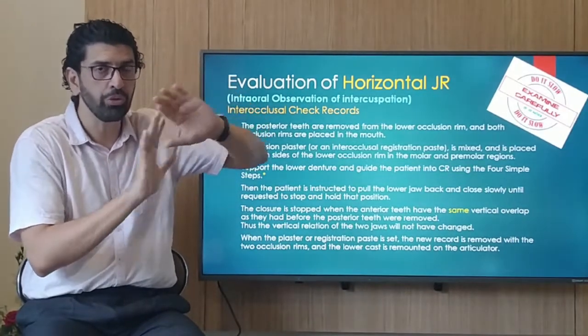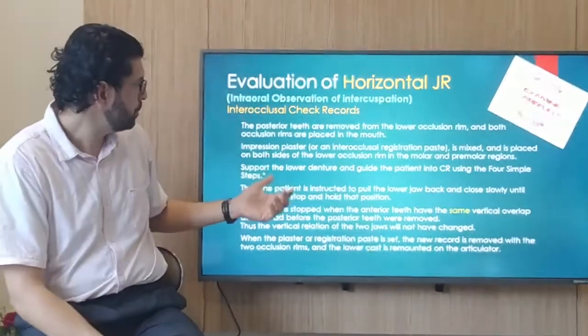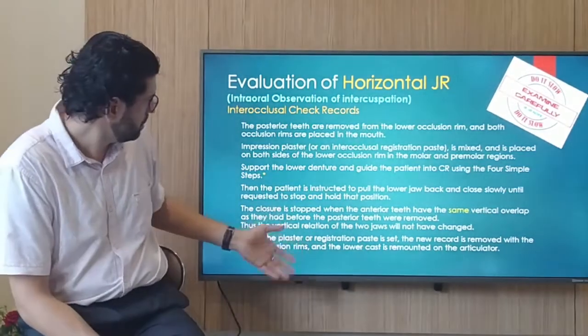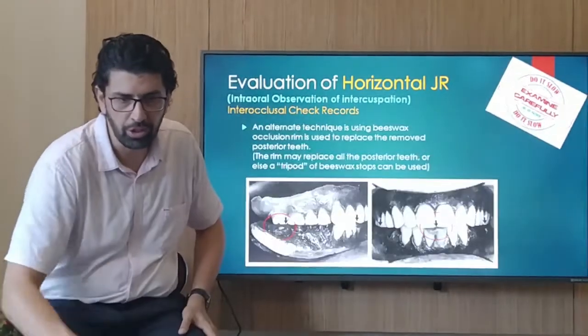When you get there, you know this is the right place. Stop. The vertical dimension is right. Stop here. Okay. So that's what you do, right? And yes, I think that's really what's written all over here. Okay. And once you do that, then you are good to go.